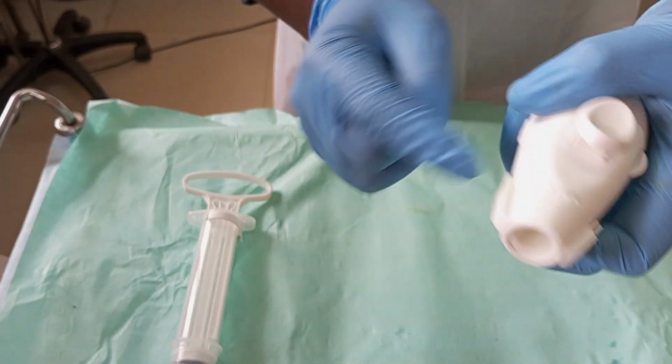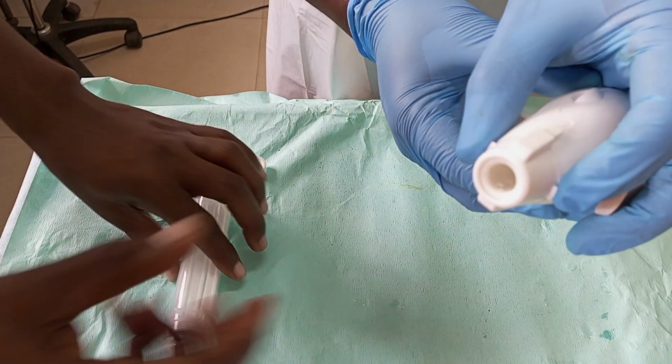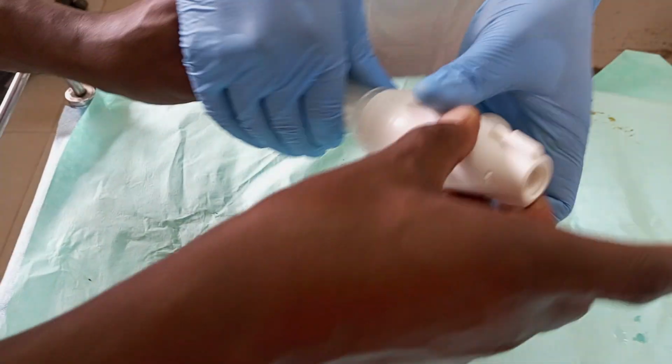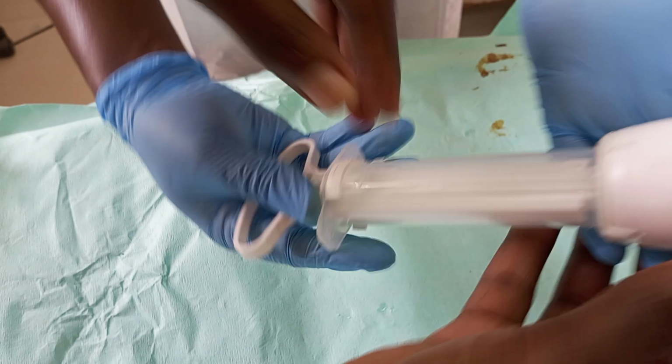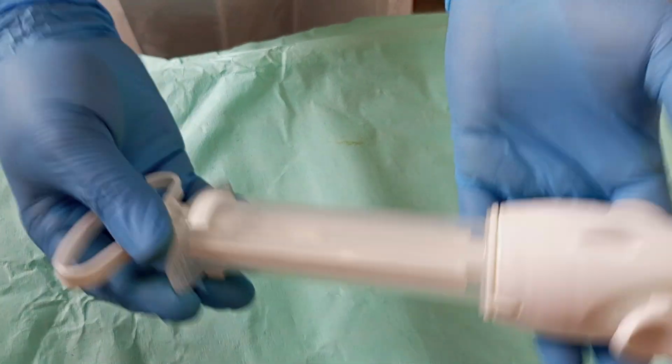For you to remove the cap easily, there are these two protrusions which you are supposed to press. Maybe the camera should visualize this properly. Maybe this side. Yes. You can see here, this is it fully assembled. Now we want to dismantle it.